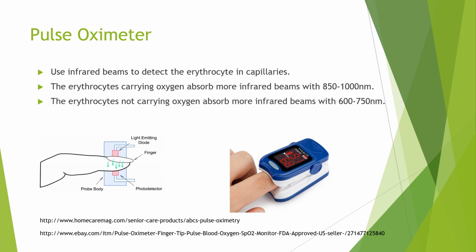But some things still interfere with the detection of the infrared, such as nail polish and deep skin color. Coldness will also affect the measurement of the pulse oximeter. So there will be one problem.